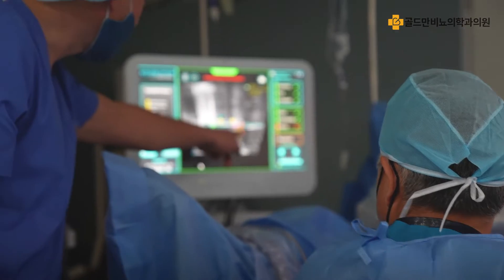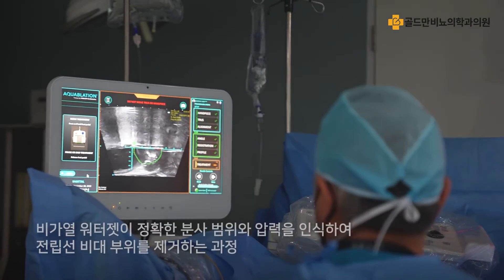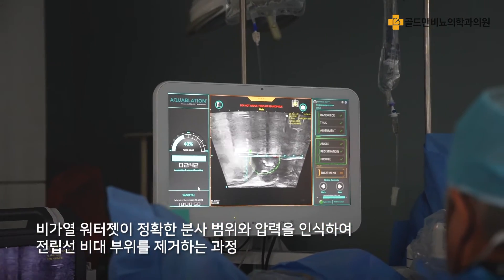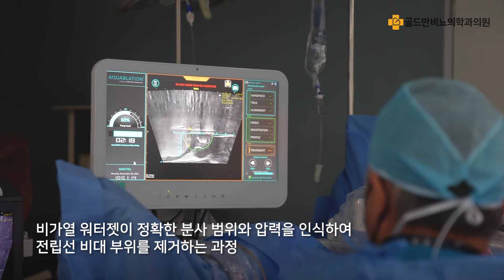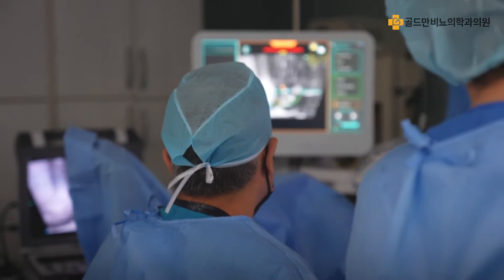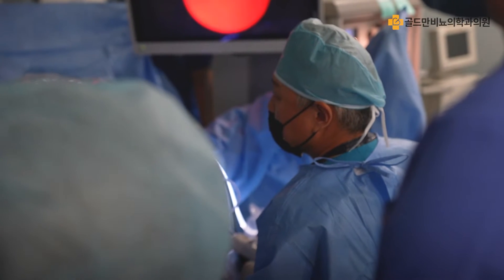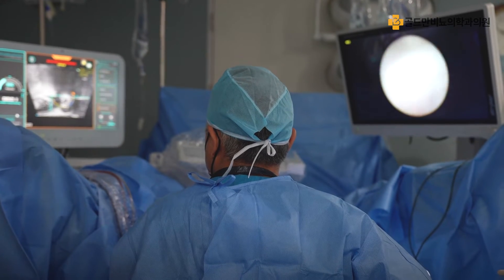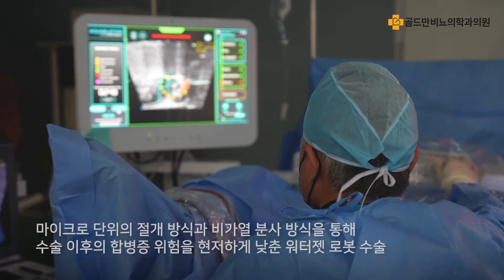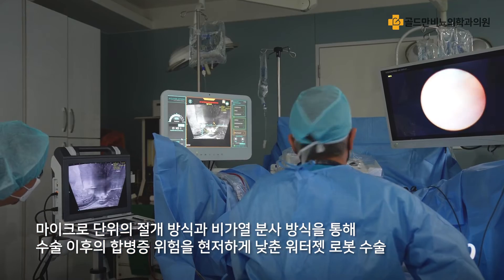Often now, to keep the clip, you can move the red one up a bit more so you get a steeper angle. You can see it here.